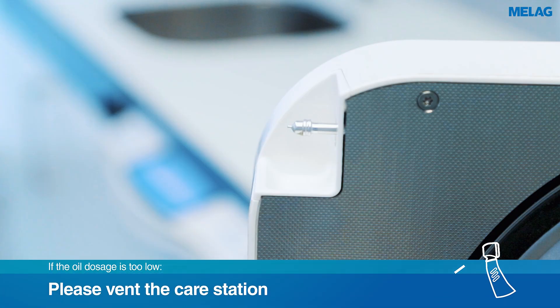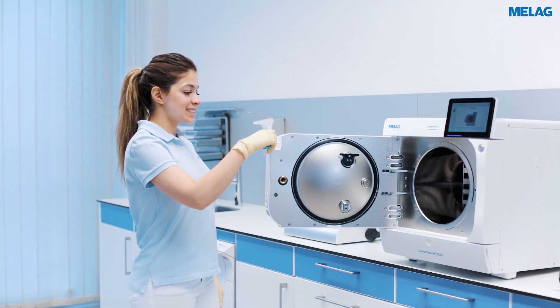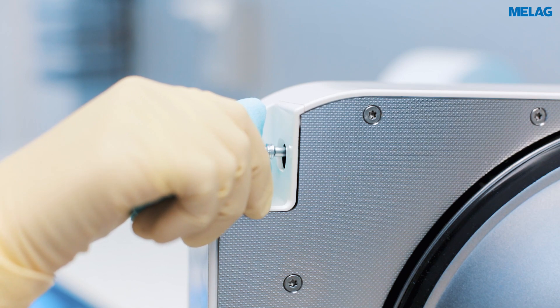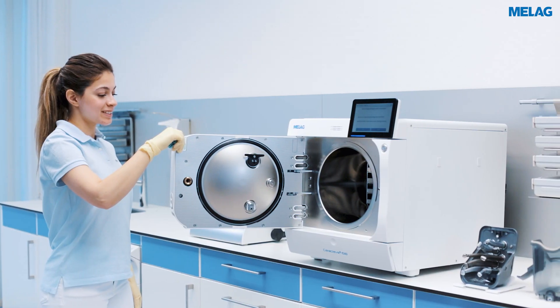If too little oil comes out of the nozzle during this process, please vent the care unit. Activate this function by pressing the nozzle for longer than five seconds and then confirming the display message with YES.